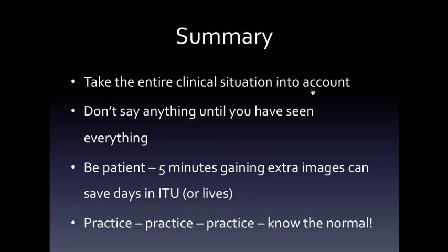A very good quote I always think is, don't say anything until you see them. So to just throw an echo probe on someone's chest and say, oh, ventricle's down, thanks, is a bad thing. And if your friendly cardiology registrar comes up and does that, slap them across the side of the face, okay? Be patient. Five minutes extra, taking very careful images and trying to do your best for the patient can save days in ICU, if you get the diagnosis right initially, if you back the right horse initially. It might even save lives if you start off with the right diagnosis.